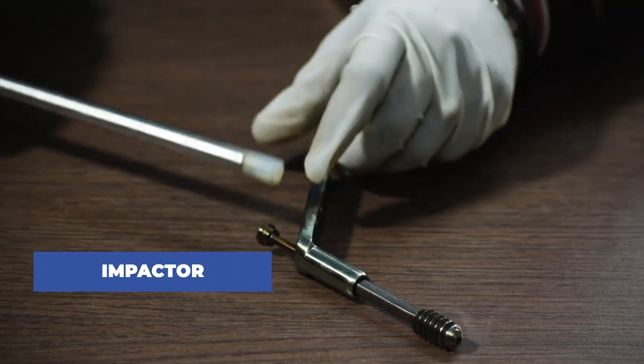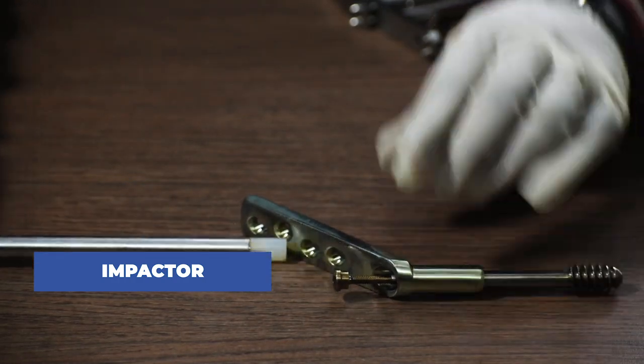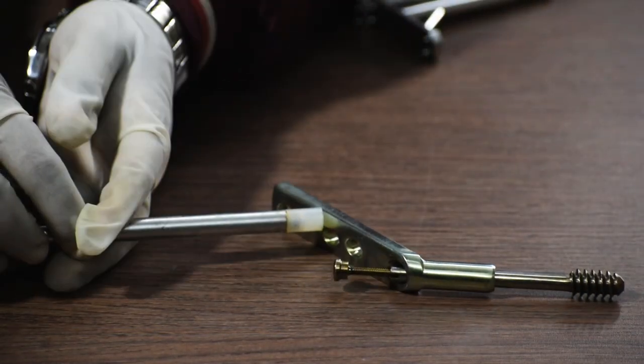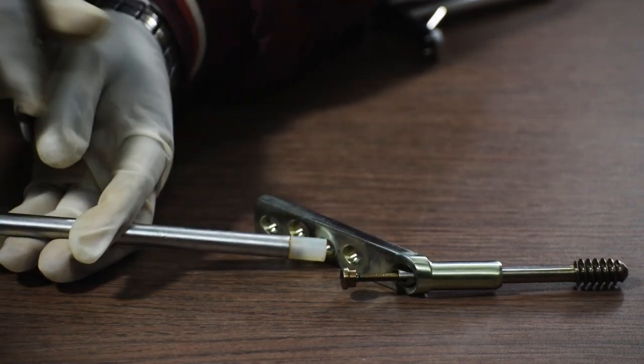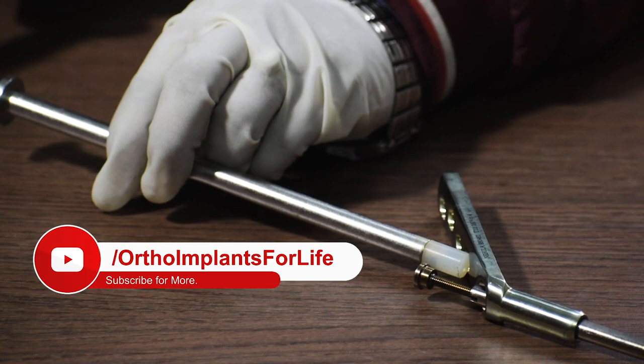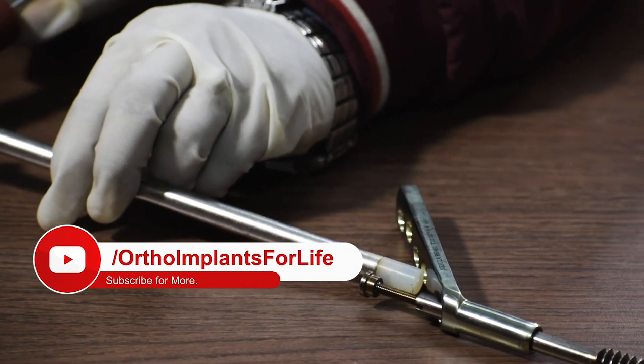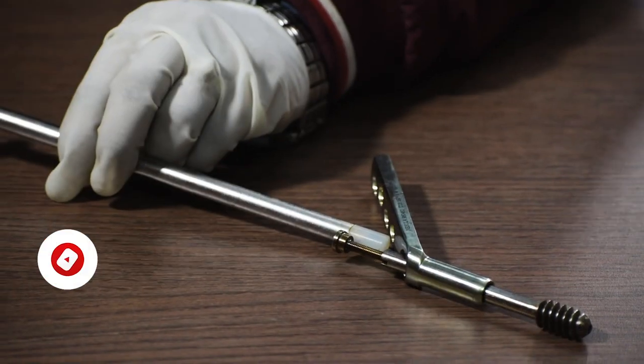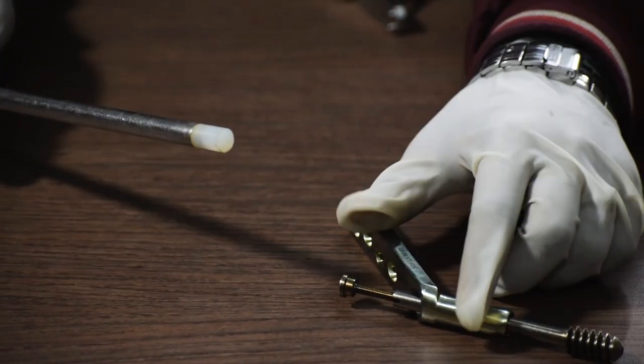Now we are going to use the impactor to punch the plate so that it is properly fixed with the bone. We will place the impactor like this and we will start punching gently from the other end of the impactor for the proper placement of the plate.